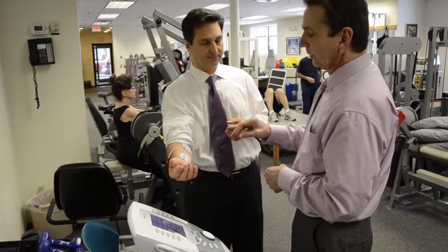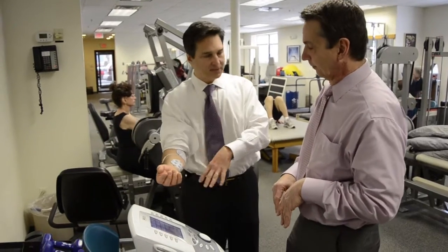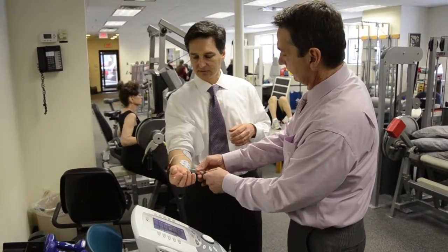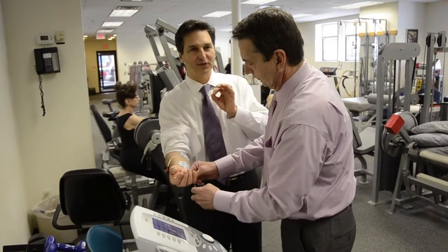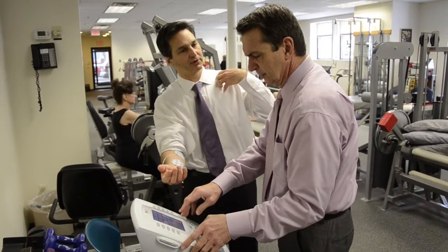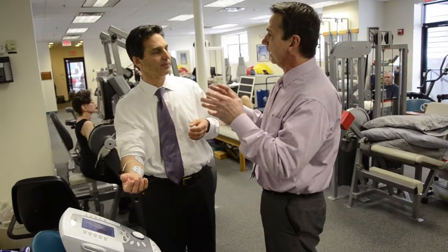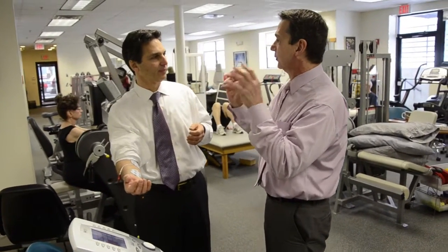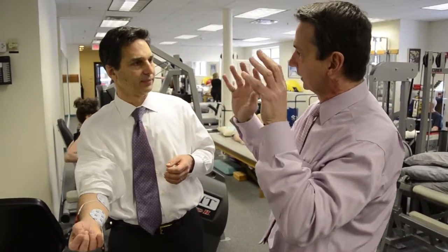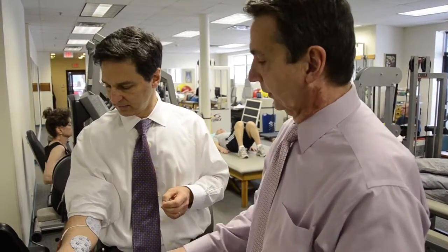Doesn't this just give them more spasms? No, because if you use the pulsing mode, it actually helps break it down. So how long will they be sitting here with this? About 15 to 20 minutes. It feels like a very slight tingle, and then you notice your muscles twitching — though not always, it depends on the intensity. In a new herniated disc, I would not use this mode — it would be a little too aggressive. They would feel more just a steady buzz, which is more relaxing. As they're less acute, we can get it deeper into the muscle, and that's when you use the pulsing mode as it's more comfortable.